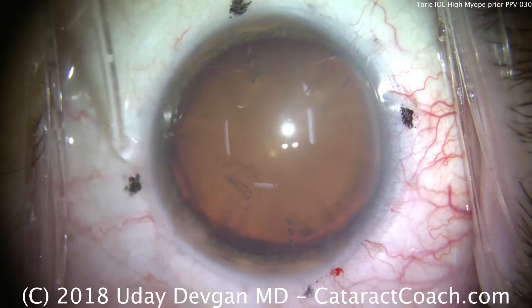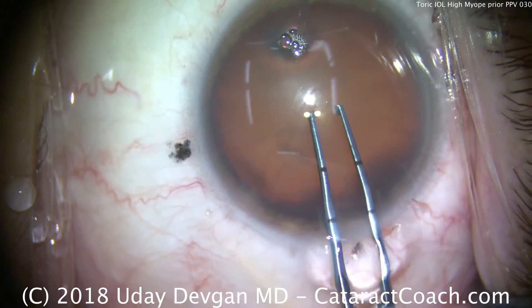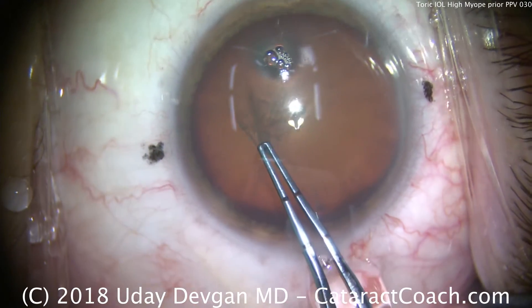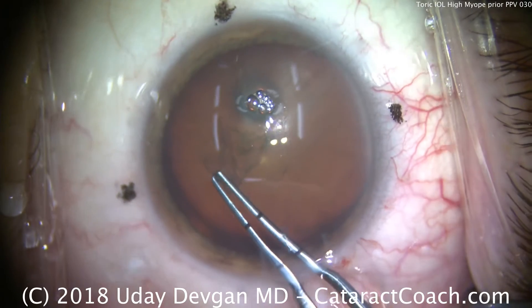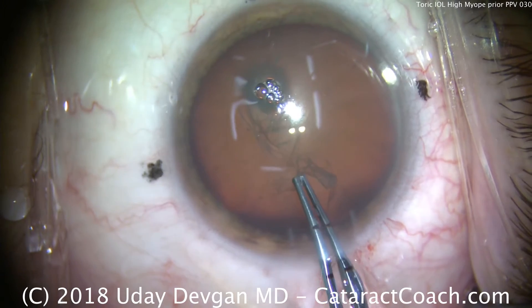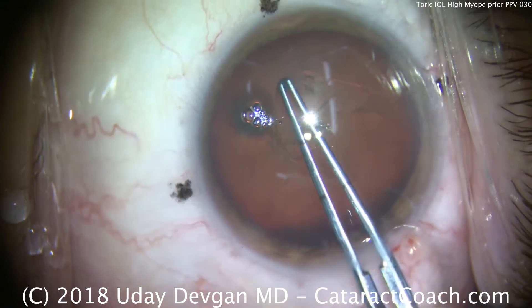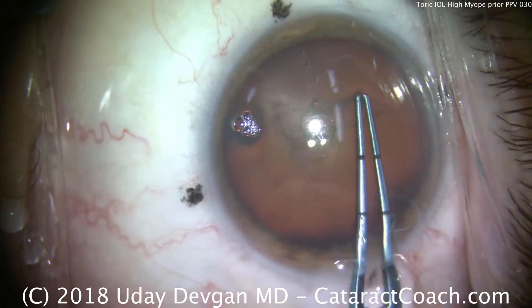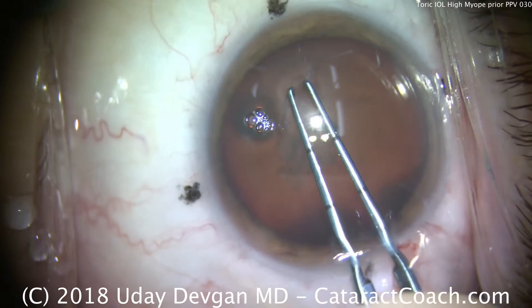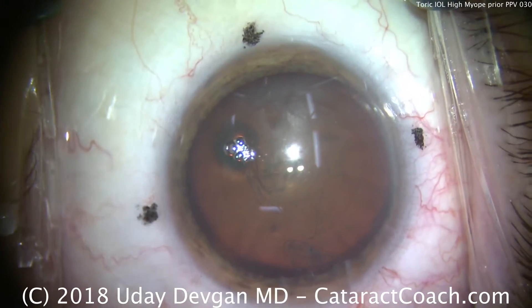We make the incision on the steep axis so we are not going to change the axis of the astigmatism at all. We create a round capsular opening of approximately 5 millimeters in diameter. This is a very myopic eye — the IOL power is 6 diopters with a small amount of toric correction. We center the capsulotomy on the visual axis because that's where we're going to center the Torque lens.